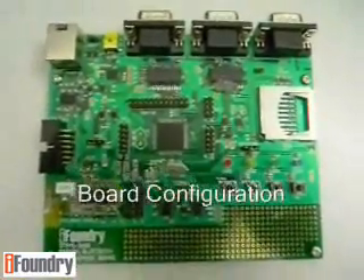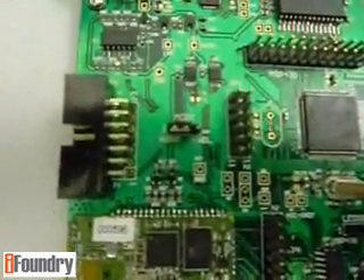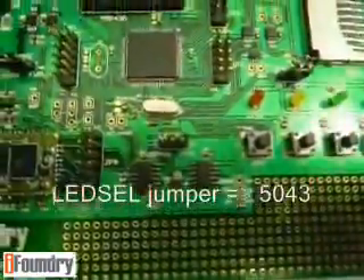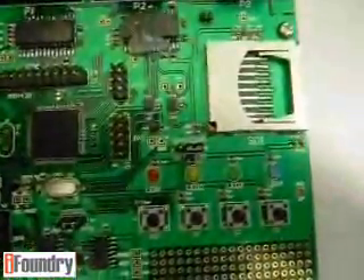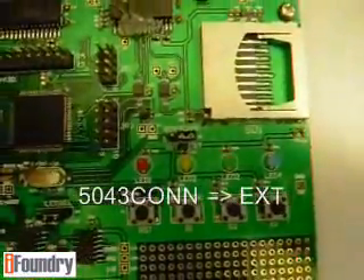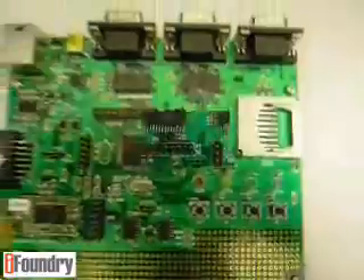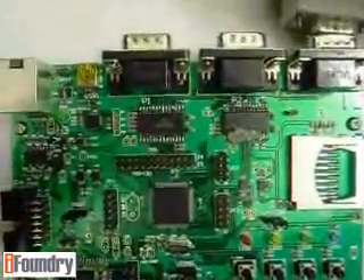Now let's configure the board. Set the mode jumper to NORM. Set the LED cell jumper to 5043. Set the 5043 CON jumper to EXT, or external. Now let's connect the pulse oximeter to the serial port.